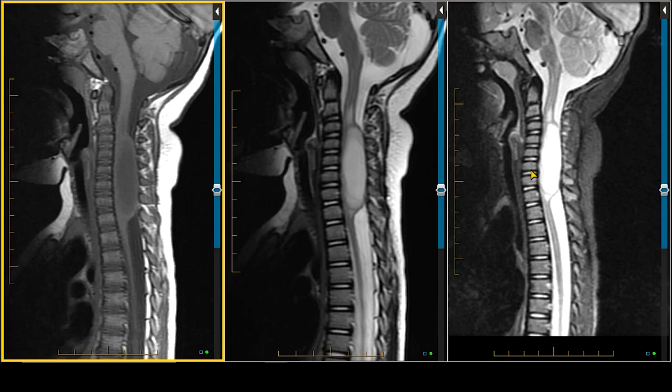Number one is that children have a higher rate of astrocytomas than ependymomas, whereas adults favor the ependymoma. Cervical spine lesions, by and large, are more commonly astrocytomas than ependymomas, whereas those in the lumbosacral region, particularly the filum myxopapillary ependymoma, occur in that location.